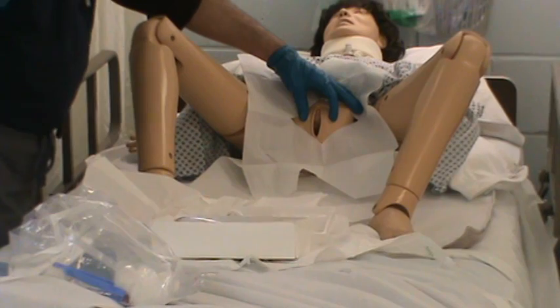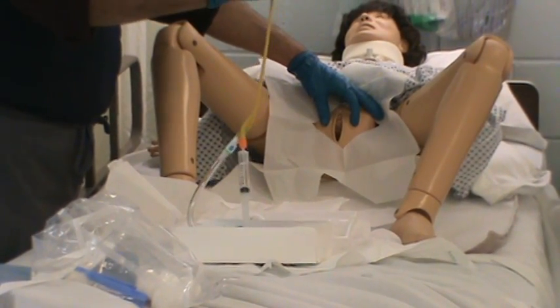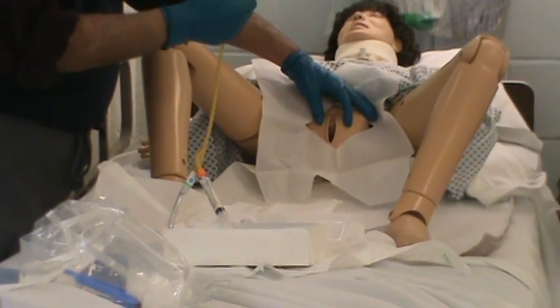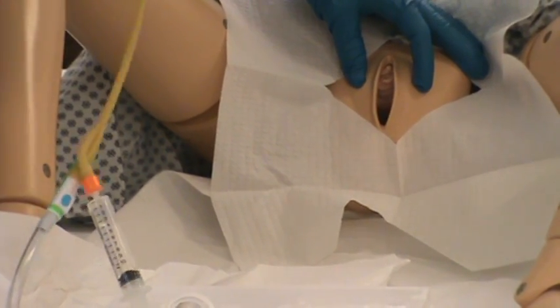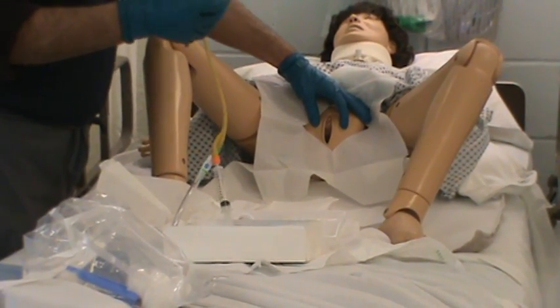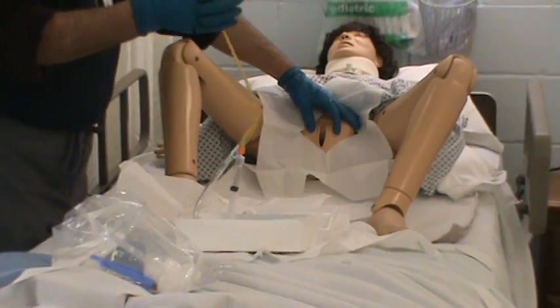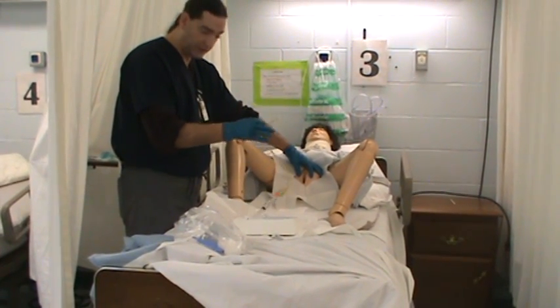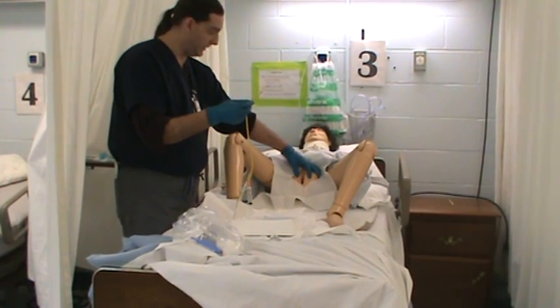Now I cannot let go with my left hand, which is holding and separating. I'm going to do all this with my right hand. On the mannequin, you can see the labia, the clitoris, the urinary meatus, and the vagina. The mannequin is hard plastic so this will not go into the meatus — we're going to put it in the vagina to simulate it. Now if you are really inserting a Foley catheter and you insert it but do not get urine back, you're probably in the vagina. Just leave it, get a new catheter, go again — you won't hit the same spot and you'll have a better chance of hitting the meatus the second time.